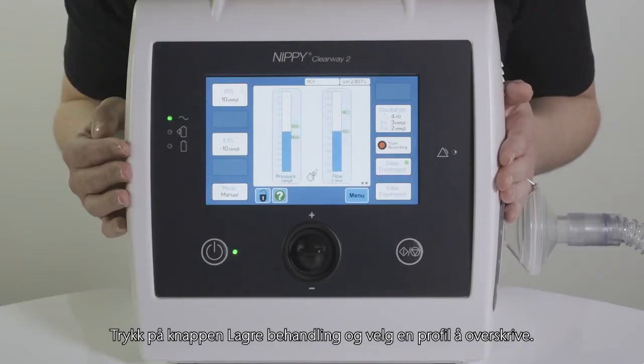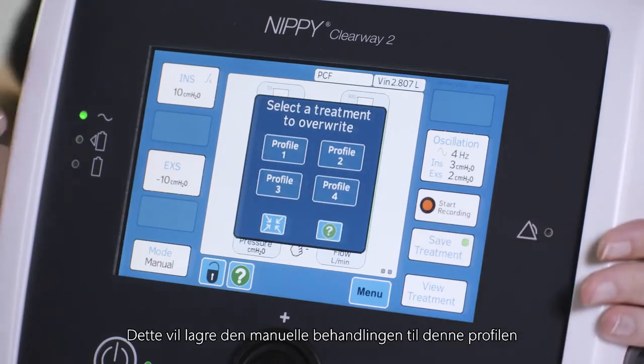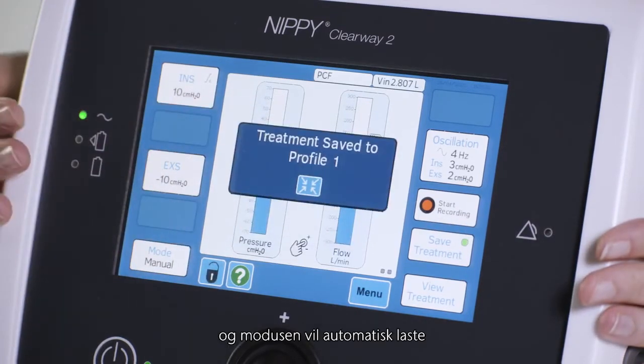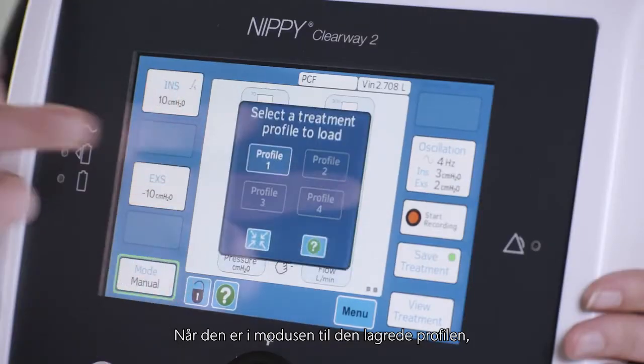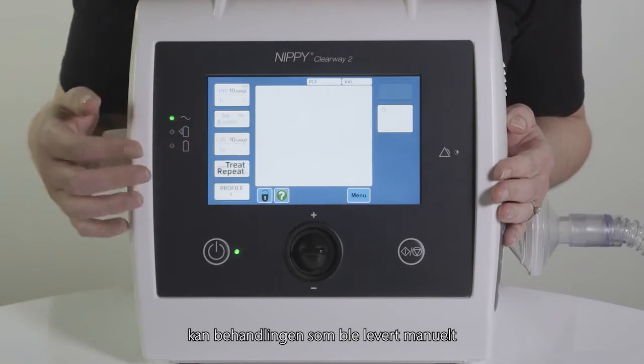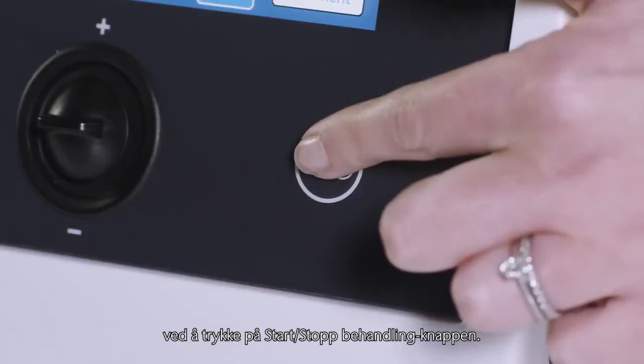Press the save treatment button and select a profile to overwrite. This will save the manual treatment to this profile, and the mode will automatically change to the profile that has been saved. When in the mode of the saved profile, the treatment that was delivered manually can be repeated automatically by pressing the start-stop treatment button.